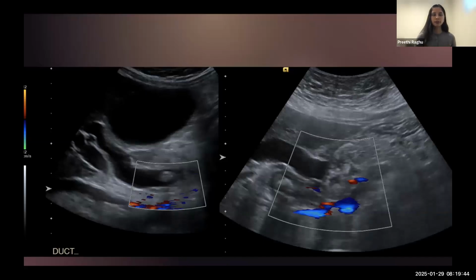And then this is another pitfall case. These are two patients that both came in with right upper quadrant pain. And having seen some of these prior images, I think you may be able to tell what we're looking at here, which is actually that distal common bile duct coming down from porta hepatis towards the pancreatic head. And I'm not showing you a measurement here, but this is a dilated common bile duct. And as we follow it down, we see this intraluminal structure. And we're putting a box on here to look for vascularity by color Doppler, and we don't see anything within that area.